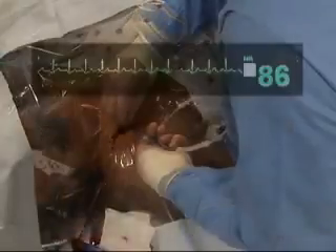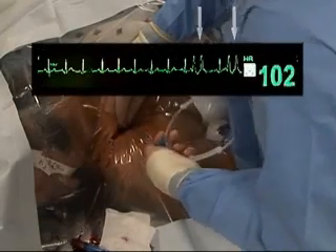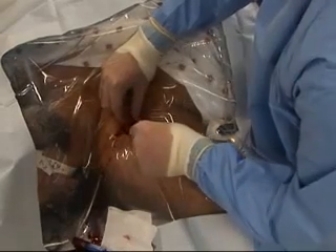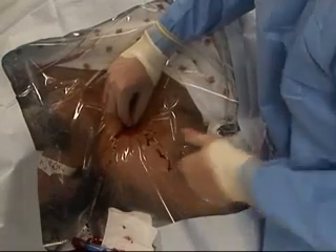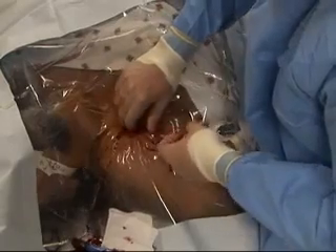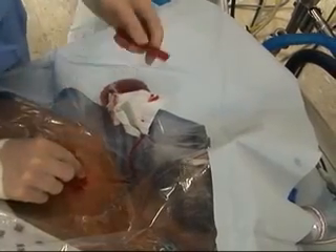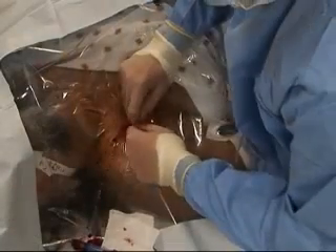An assistant should watch the monitor looking for signs of arrhythmia during advancement of the guide wire. Arrhythmias indicate that the wire has reached the heart. If arrhythmias occur, withdraw the wire slightly until they cease. After the guide wire has been inserted, withdraw the needle, leaving the guide wire in place. Using an 11 blade scalpel, make a small superficial incision at the entry point of the wire to facilitate passage of the dilator through the skin. Be careful not to cut the wire.